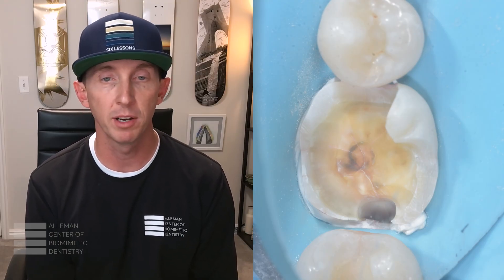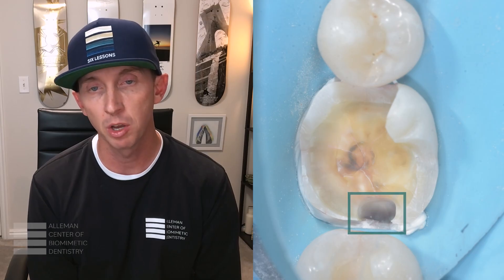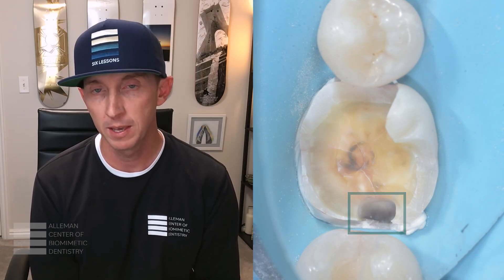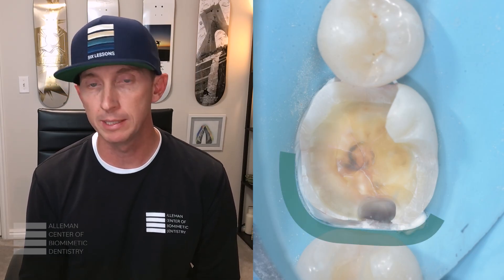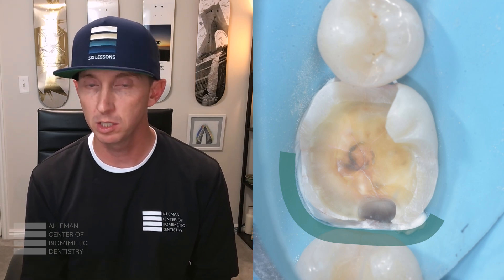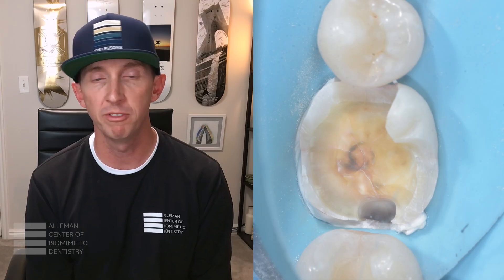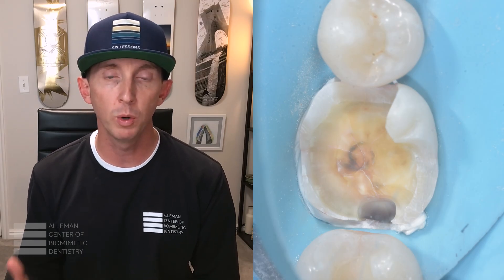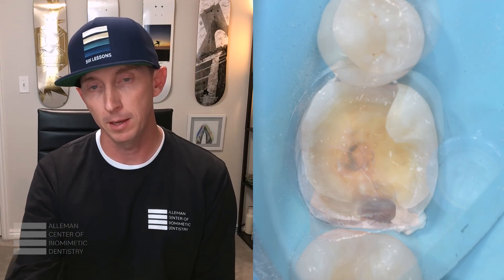Let's focus on what we see here in this image. Right now, we have a crack-free peripheral seal zone. The distal fracture is right on crestal bone. I've packed Teflon between the dam and the tooth, and this is creating a separation of the PDL fibers, which will become very important as we do a matrix-in-matrix technique with very specific bands.